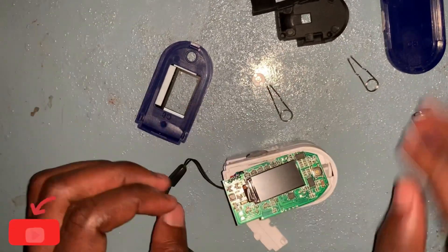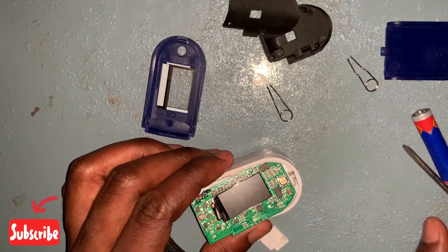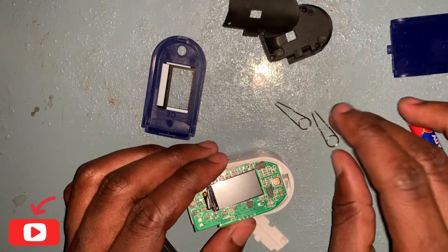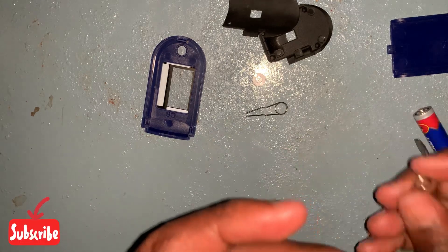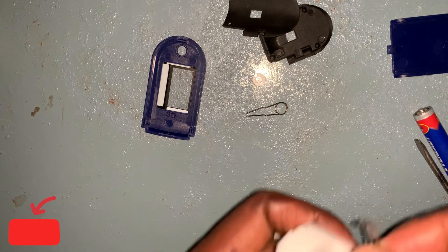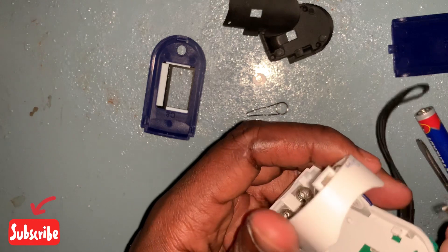Now we will reassemble this device. One of the most challenging things in assembling this device is the two pins — they are the most challenging part in both assembling and disassembly. Let's begin with these two.